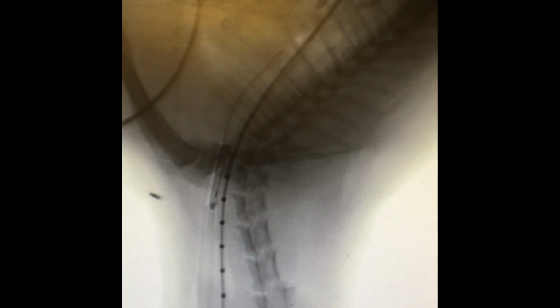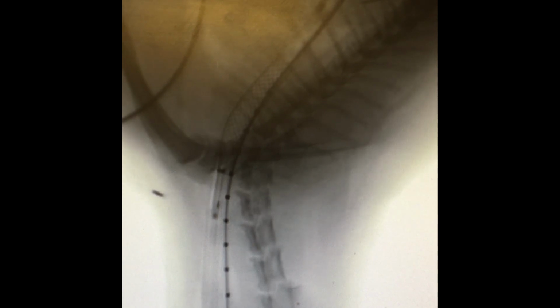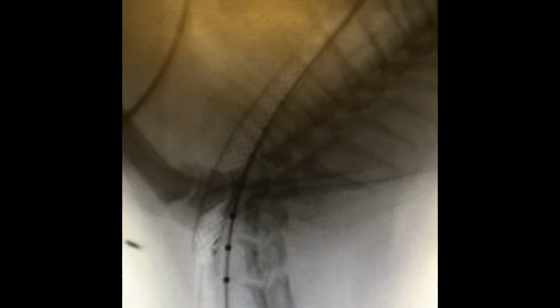Most patients will show immediate improvement following this procedure, 75 to 80% not requiring any further medical treatment to control their breathing signs. There is follow-up, and it's recommended that these patients be seen every 3 months for evaluation and chest X-rays to make sure that they continue to do well at home and that the stent has not moved.